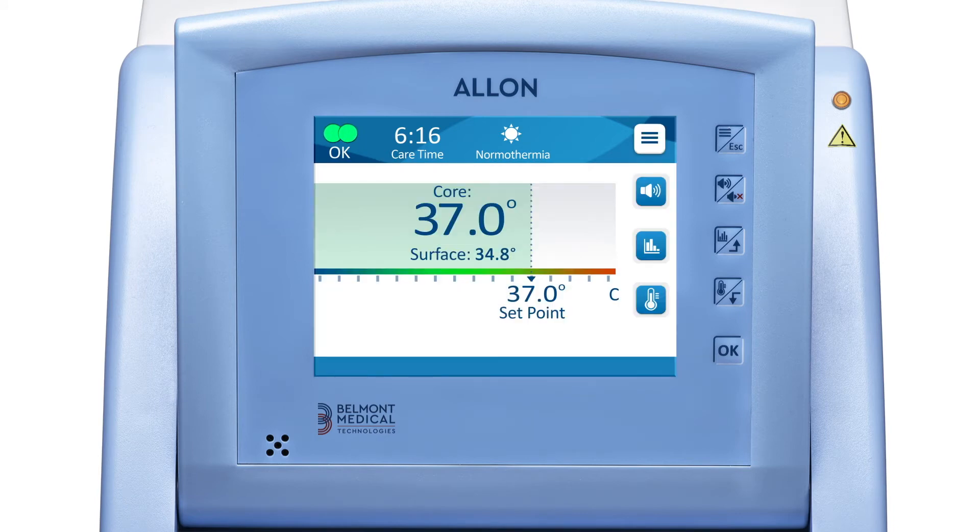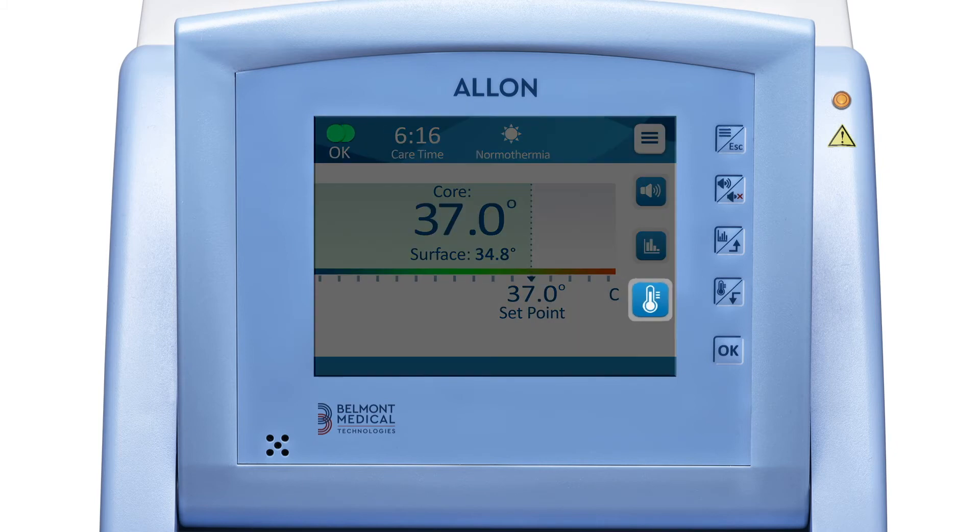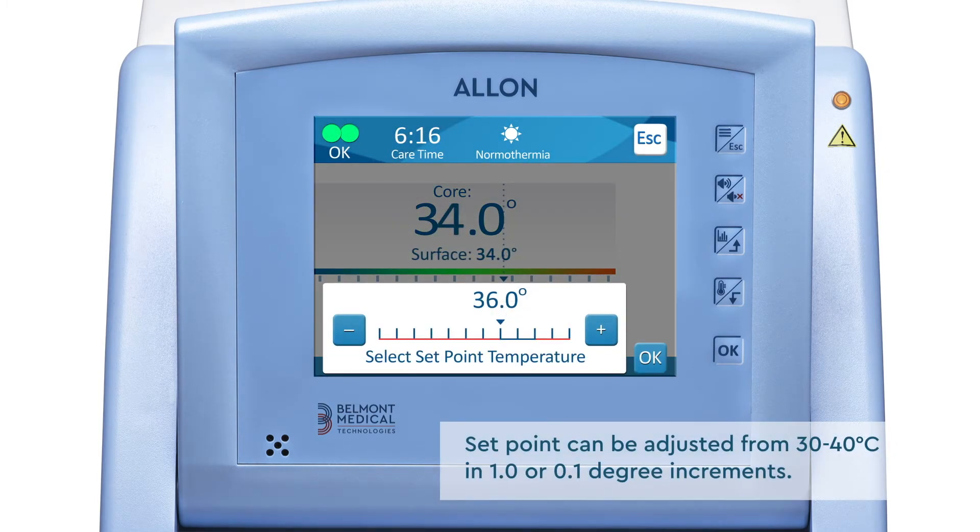To adjust the set point of the patient, press the set point key. You can choose a patient's set point from 30 to 40 degrees Celsius in 1 or 0.1 degree increments.